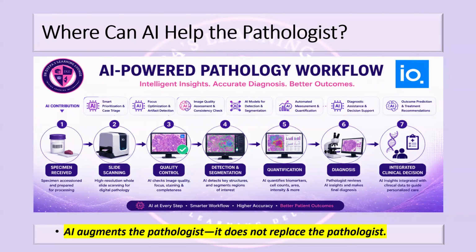If AI can support every step in the workflow, then where do you think it delivers the greatest value today? In my opinion, it is not replacing the diagnosis, it is eliminating the repeated, redundant tasks and frustrations that we have on a regular basis. Today, in my workflow, if my technician forgets something, the clinician will call me and say, I gave you this particular slide that day, you haven't done it yet. I am frustrated. I will try to expedite it. It can get processed well, or it may not get processed well because I'm bulldozing it.